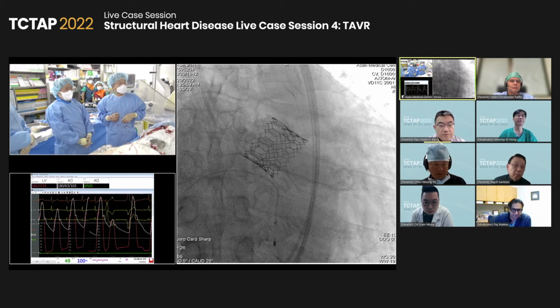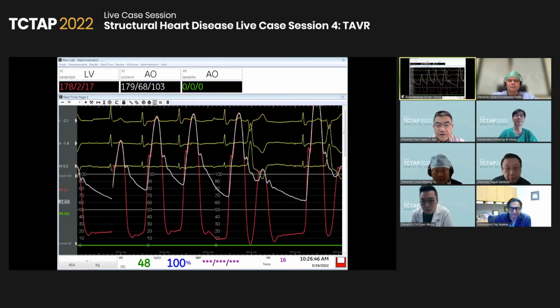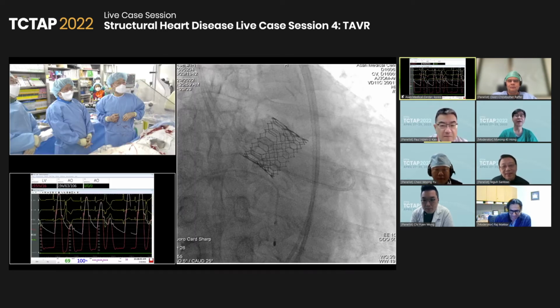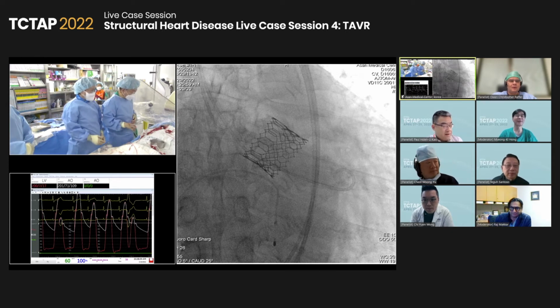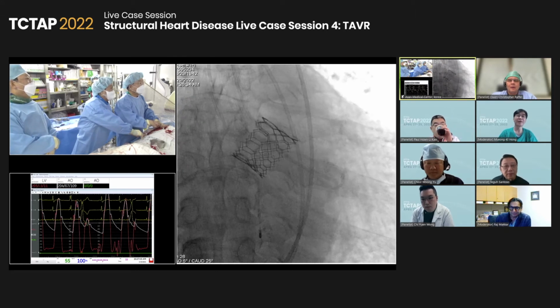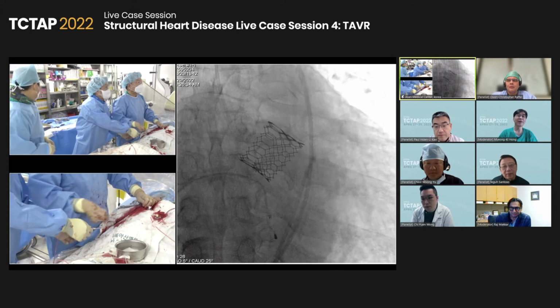Did you see the pressure monitoring? Yeah, it looks perfect. Yes. All right. It's perfect. I bet that one, right? I bet if you take an aortic shot now, there will be less AR. Yeah, I think that's the wire bias. Please. Even the AR index is perfect, and so I'd like to pull back the LV wire. I think it's okay.